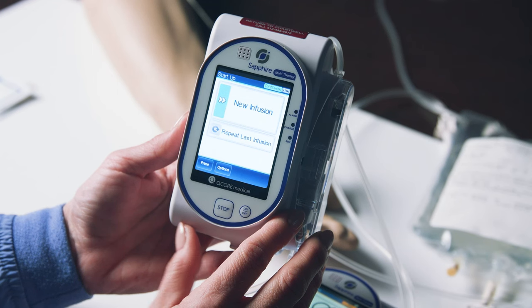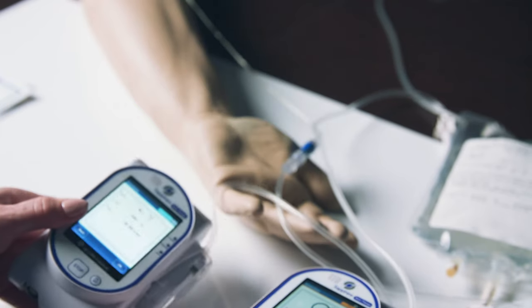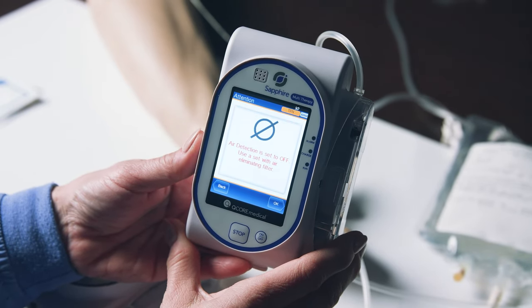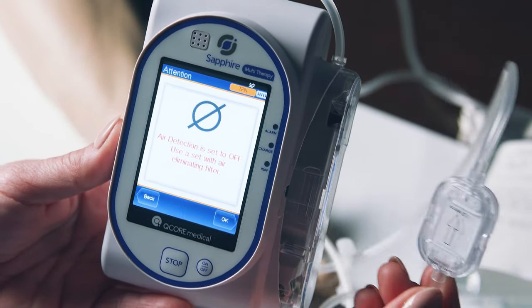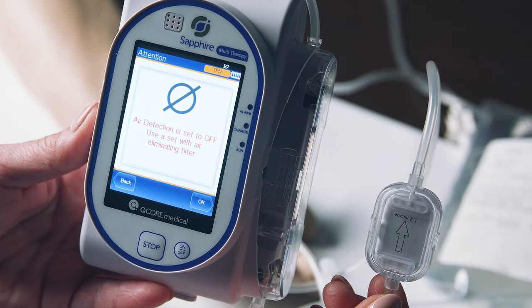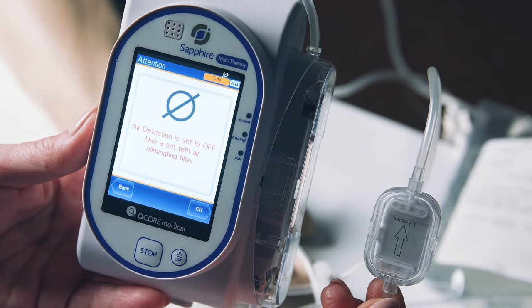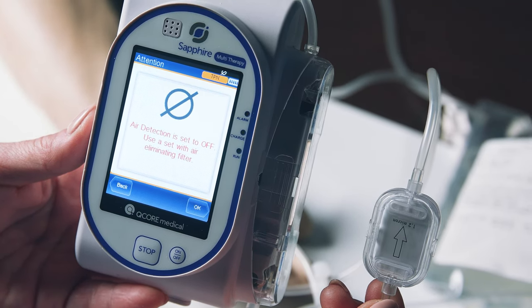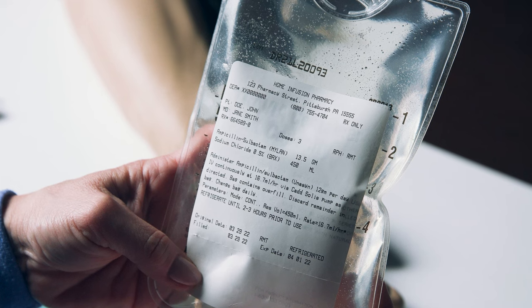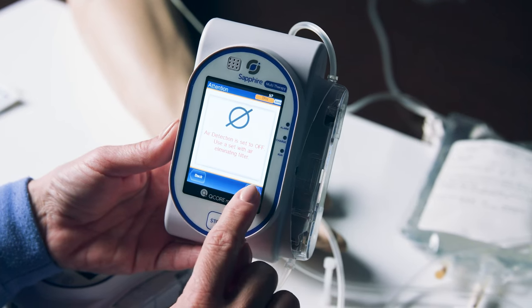To start your medication dose, press Repeat Last Infusion. When you press Repeat Last Infusion, your pump will either display the pump's settings or display the no symbol and read 'air detection is set to off.' If your screen displays the no symbol and reads 'air detection is set to off, use a set with air eliminating filter,' you must verify your tubing has an inline filter. All Sapphire inline filters are air eliminating and will not allow air to pass through the filter to your IV catheter. If your pump has this alert and your tubing does not have an inline filter, do not start your medication dose and call your pharmacy at the number listed on the top of your medication prescription label. Once you have confirmed your tubing has an inline filter, press OK.